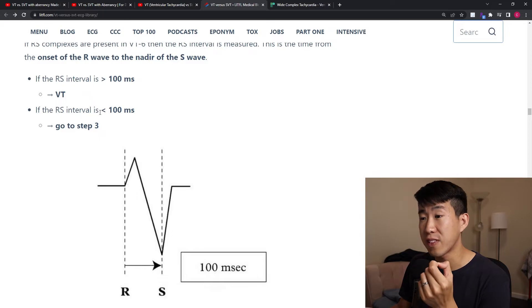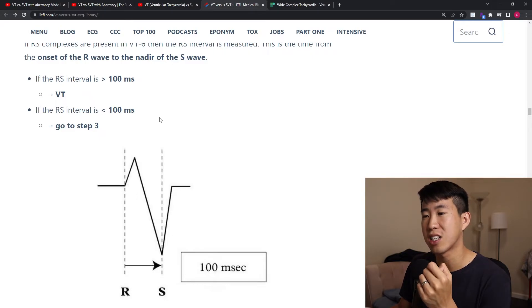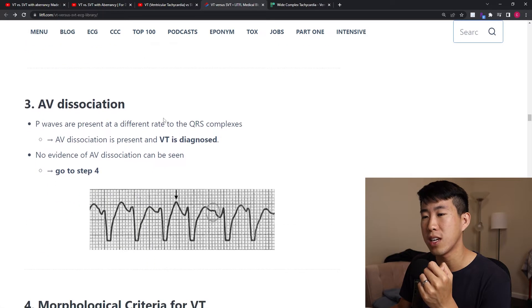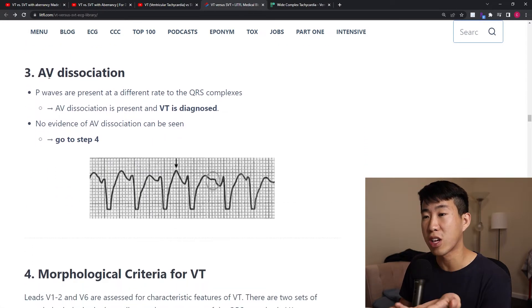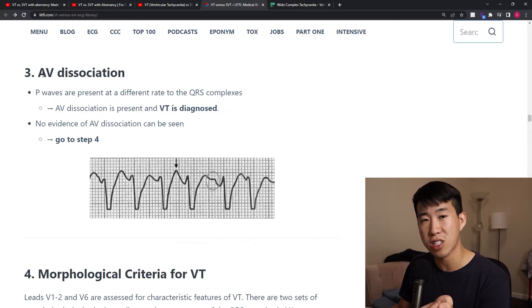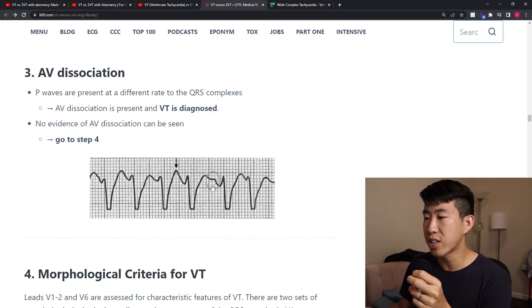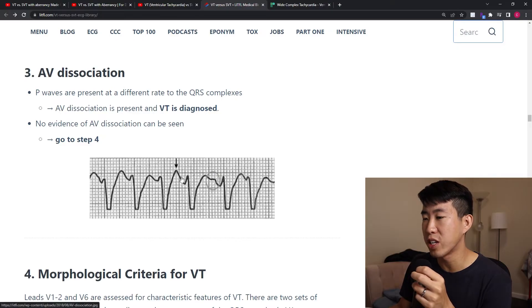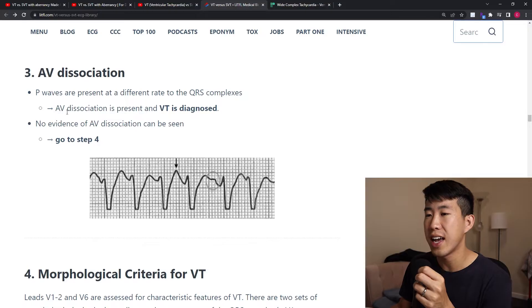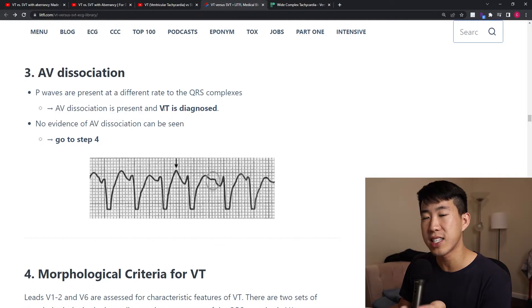Step three is looking for AV dissociation, which is highly specific for VT. Here you can see P waves with really no correlation to the QRS — a P wave embedded here and then here. If AV dissociation is present, VT is diagnosed.